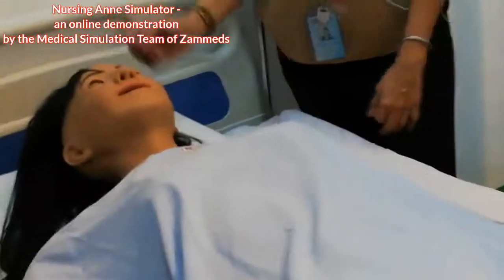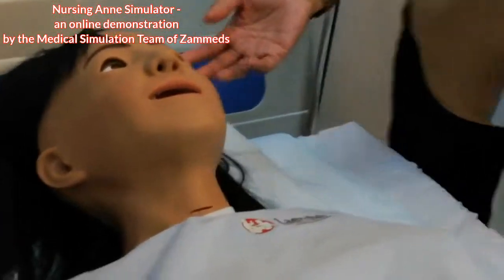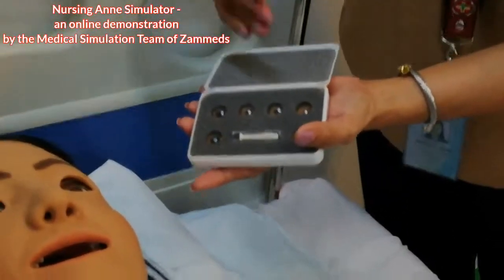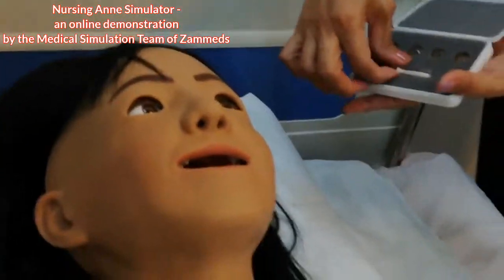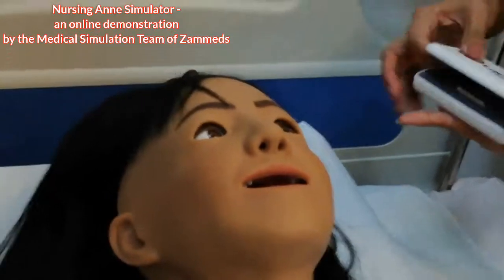For the eyes, as you can see, our nursing aunt has blinking eyes and we can replace them. They can be blue or brown. Here are the replacement options. The nursing aunt has contact lenses.